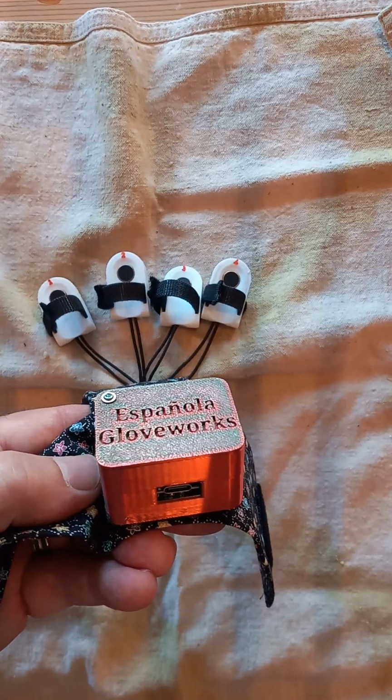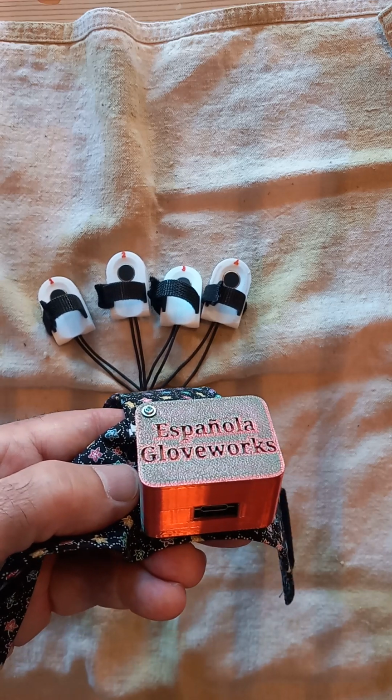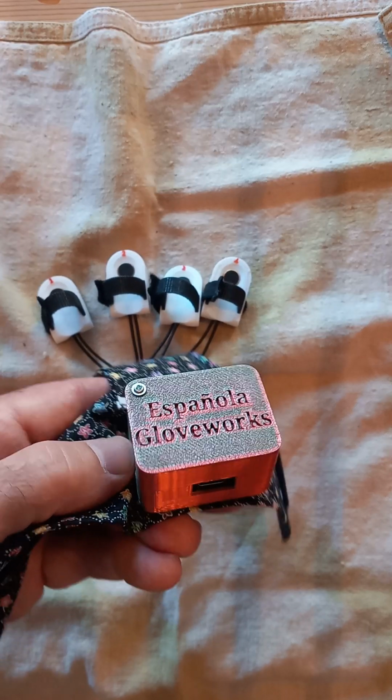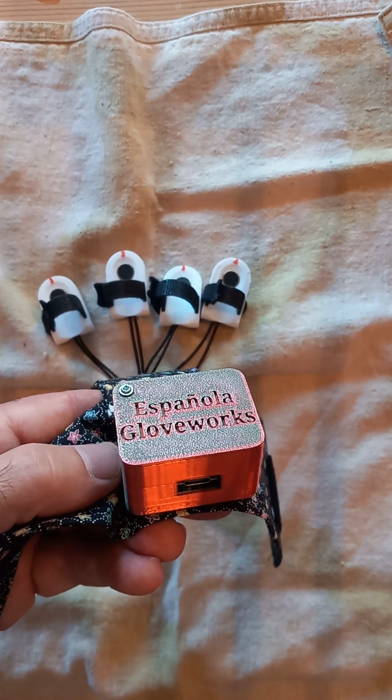I find that the batteries last about 5 or 6 hours, and so wearing them for 4 hours a day, it's best that you charge them overnight. I see the charge takes about 1 to 2 hours, depending upon how long you wore them.